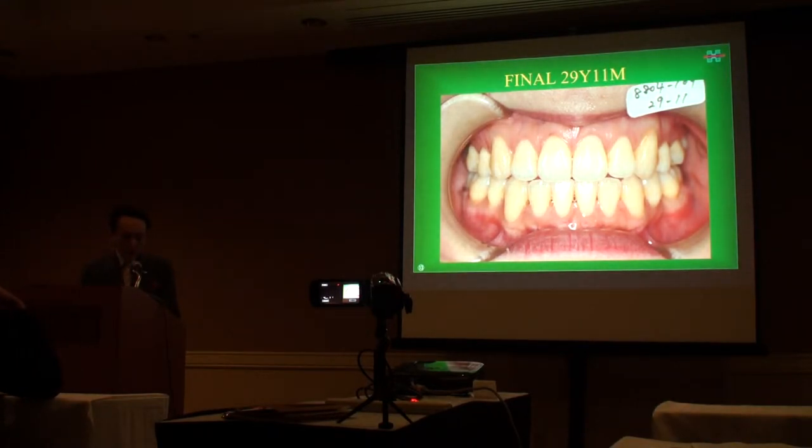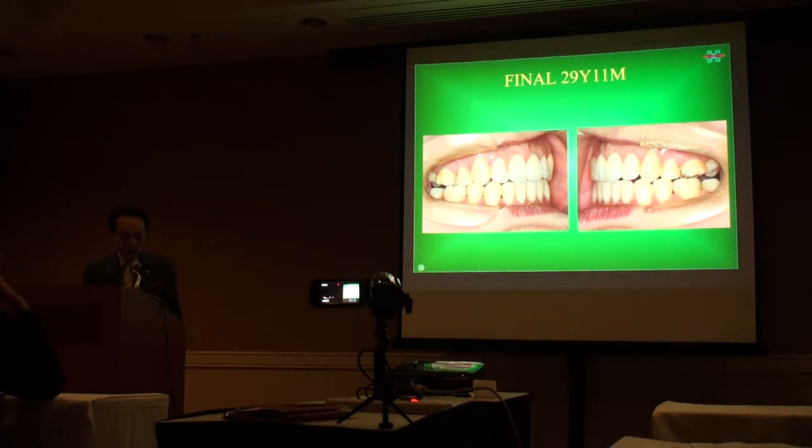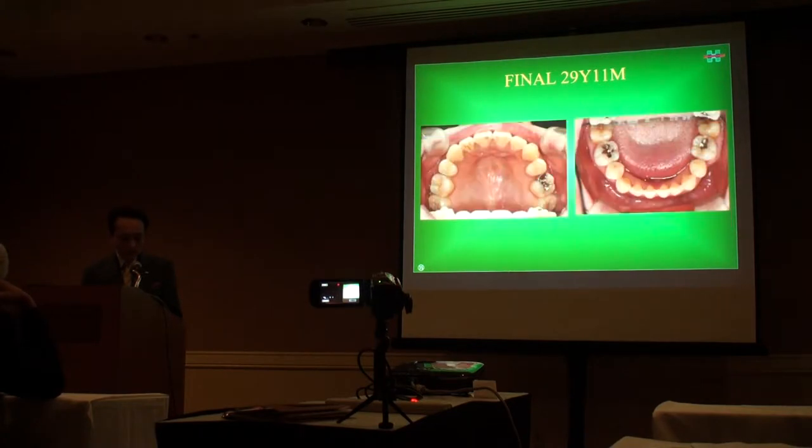The crowding was eliminated and the dental midlines became coincident. The overjet decreased from 5 mm to 1 mm, and the overbite from -2 mm to +1 mm. The right molar relationship was improved from Angle Class 2 to Class 1. The lateral view shows good intercuspation of the teeth on both sides. The second molar was distalized and the Tweed occlusion was created. The crowding was eliminated in the upper and lower arch, and a symmetrical and U-shaped arch form was established.